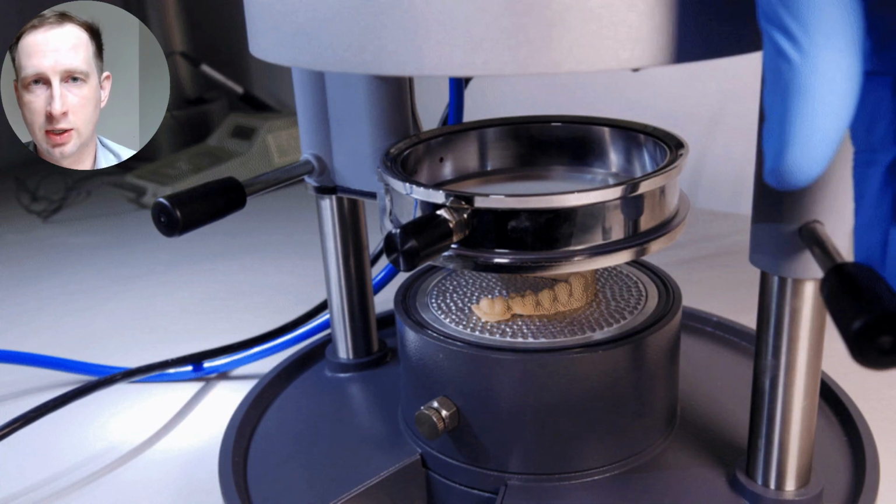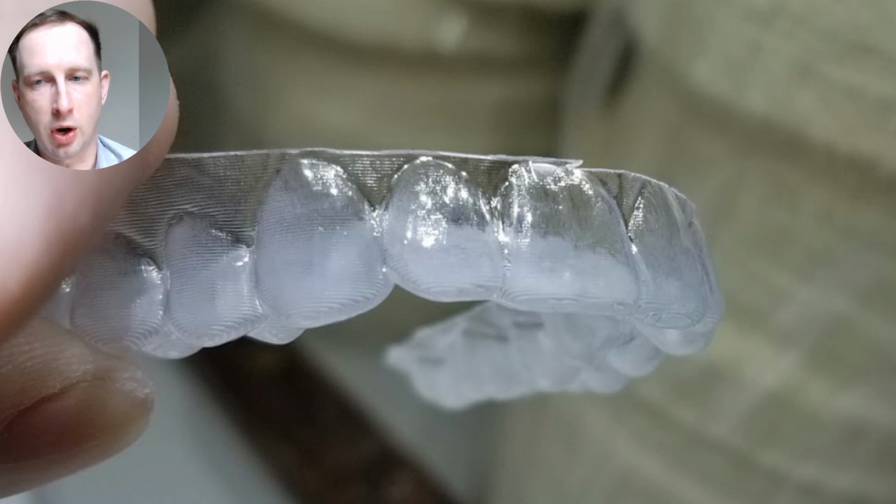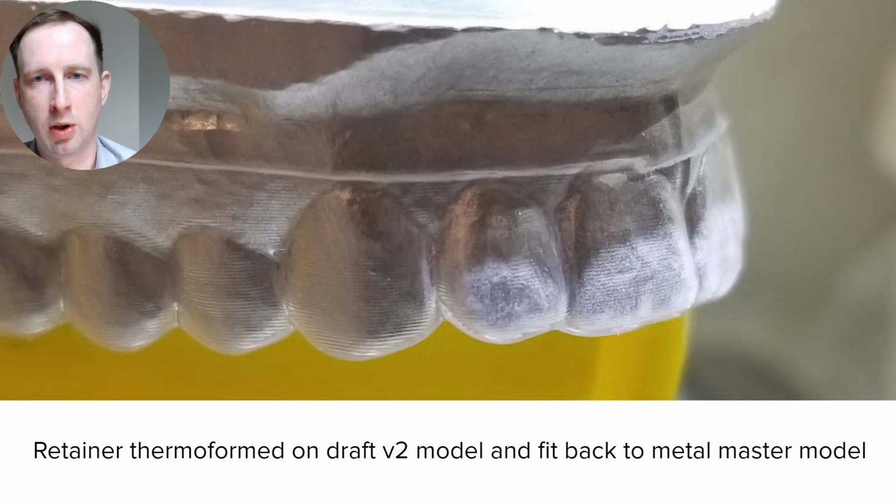And so just like I had explained before, we thermoformed on those models. Sorry for the bad photo here, but this is the first appliance I made on Draft V2 at 200 microns. And I thought to myself, hey, that doesn't look too bad. I think it's also important to note that the largest aligner manufacturer in the world prints their models at 200 microns. So there might be some sort of sweet spot in there, but I'll leave that for you guys to decide. We put the appliance back on the master model, and I was blown away by the fitment.